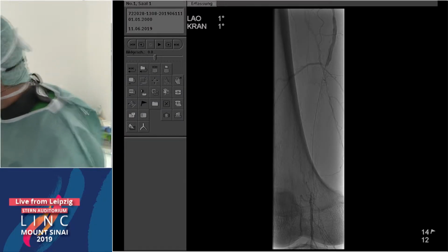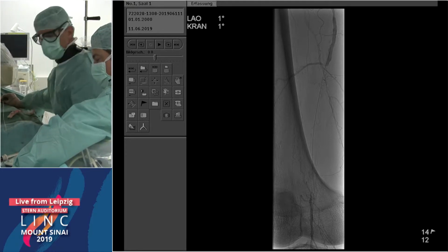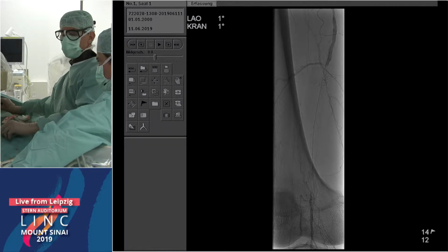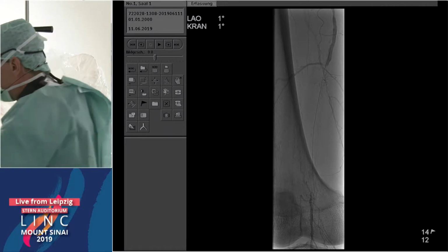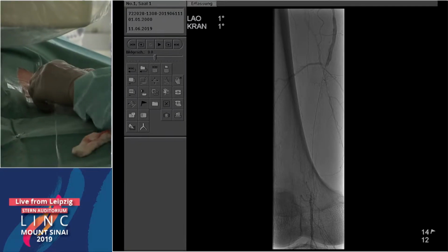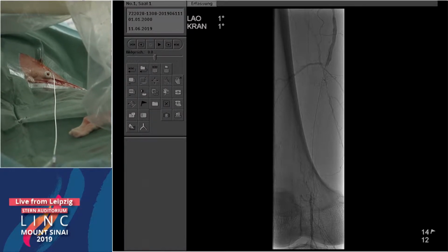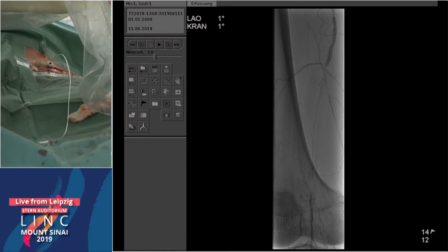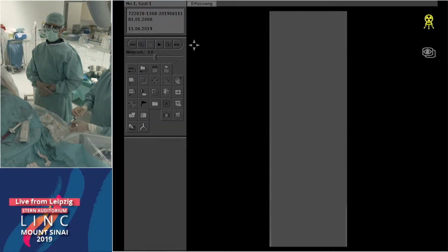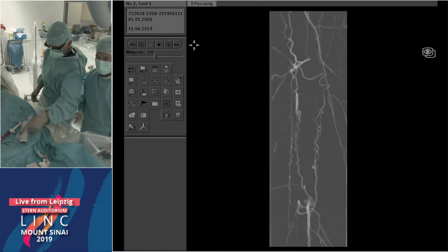I think the one challenge, Andre, as you mentioned to begin with, is this pretty small vessel that you're trying not to stent. When you get around that plaque, it's harder to think that you're going to come up with a strategy that you won't need a scaffold there. You can DCB and add a Supera, but it'll be a pretty small Supera. So it is challenging whether you'll be able to complete this procedure without needing a scaffold if you continue down this road going around there. So, Andre, I understand the strategy here is to stay with the drug-coated balloon as much as possible and avoid an implant, right?